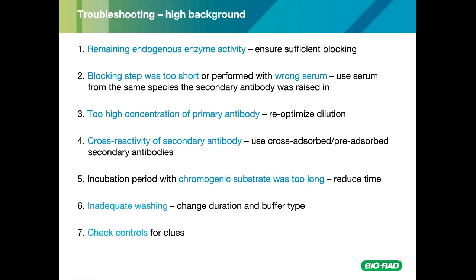If you have the suspicion, leave a small amount of serum in a vial at room temperature overnight on your bench and check for growth the next day. You could also move the serum to 37 degrees if you wanted to. You can spot a contamination by the serum getting cloudy, and this is normally a sign of bacterial growth. In addition to the serum, it could also be the case that your antibody is indeed contaminated.